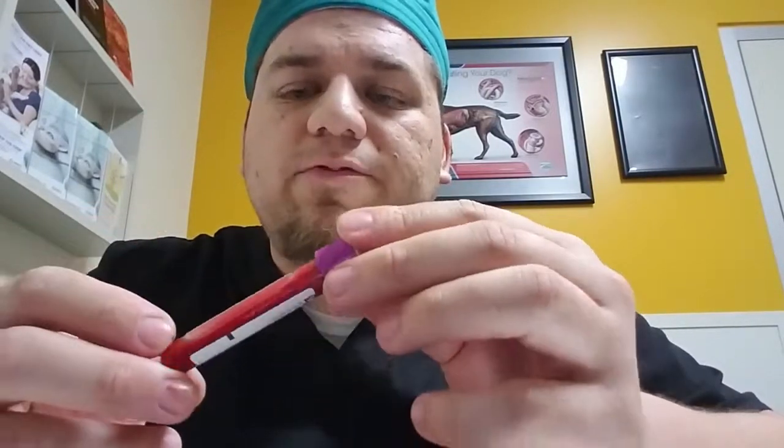Hey guys, so right now I'm going to show you how to do a PCV for a patient that came in feeling a little under the weather. His name was Campeon. So this is the blood tube, the EDTA tube that we have his blood in. I'm just going to invert it a couple of times so that way we make sure the blood is well mixed.